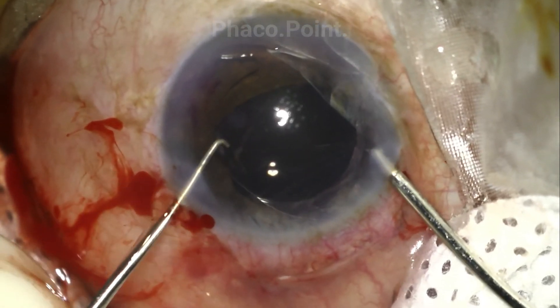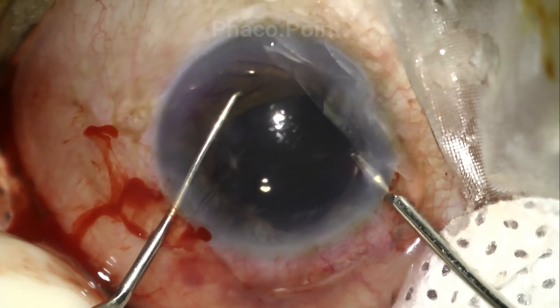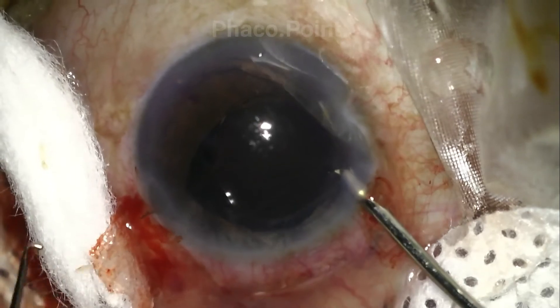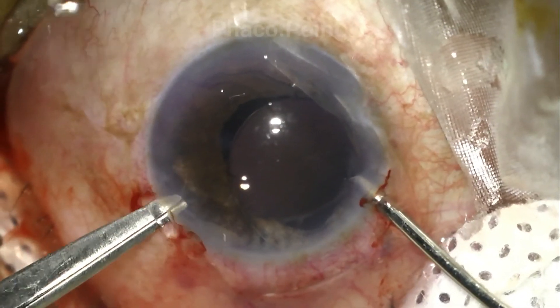Whilst supporting the optic with the left hand using a Sinski hook, the surgeon grabs hold of the optic with intraocular forceps.